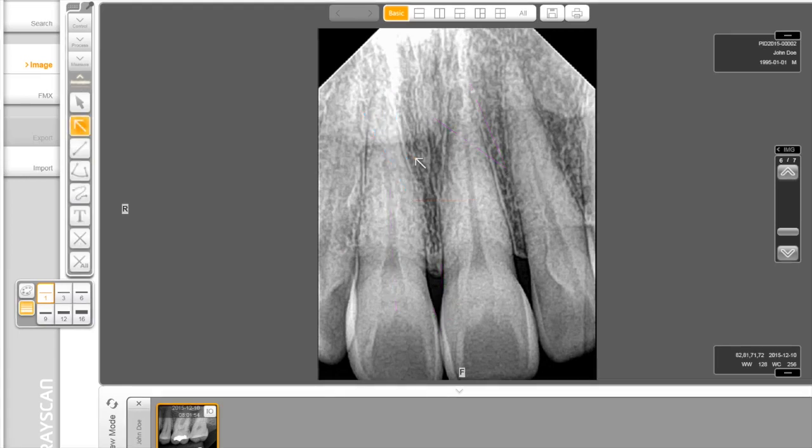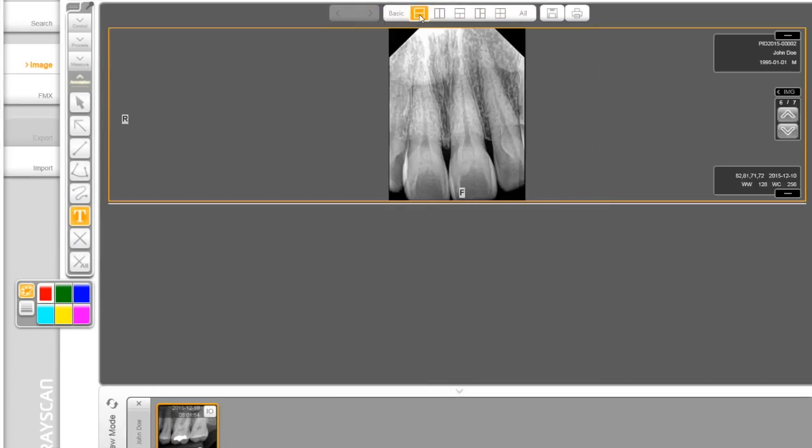Finally, you can put an arrow and draw a line in the image under Annotation. If you would like to change the thickness and color of the line, click the option as shown. Also, you can do a polyline and free drawing. And you can put some text. The Compare Images function allows a user to view up to 5 images in a side-by-side comparison window. This tool allows a drag and drop function.